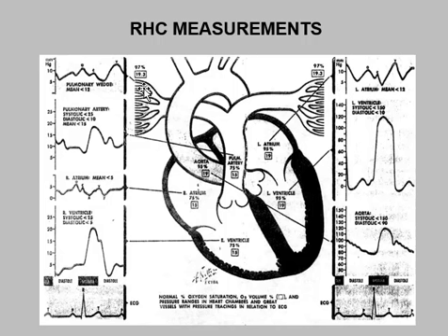Well, that occluded vessel, distal pulmonary artery, is actually recording the retrograde pressure from the left atrium. And that left atrial pressure is also the same as the left ventricular EDP.